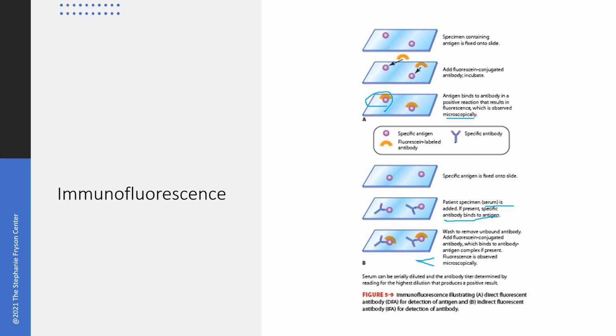So the first one was direct. The second one was indirect. But it has extra steps, so it takes a lot of time. How long you have to incubate it takes a lot of time, and it's labor intensive, so it's not used as often.